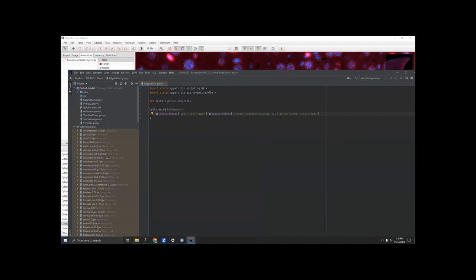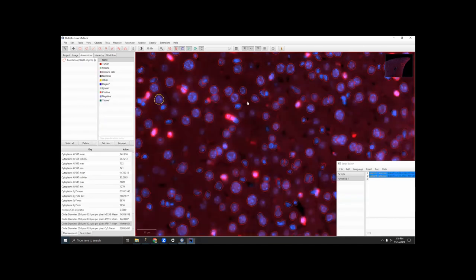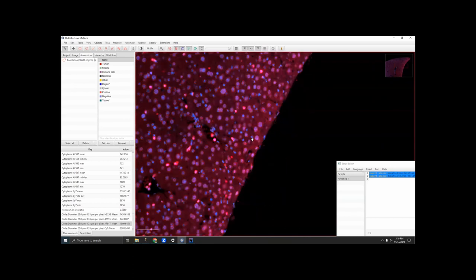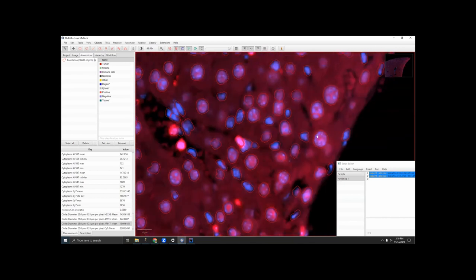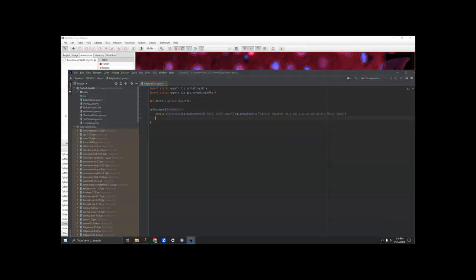So now I'm doing the subtraction, and I'm going to call this the difference. And I'm just going to specify that it's a double, because why not? You could also just use def, it doesn't really matter. I just like to be clear about it when I can be. Honestly, with this type of edge artifact, I'm never sure whether it's an additive or multiplicative artifact. So whether we should be subtracting this background or dividing by this background. So I'm going to just calculate them both and we'll deal with it later. So I'm going to just copy paste this whole line, call this ratio, and instead of subtracting, divide.